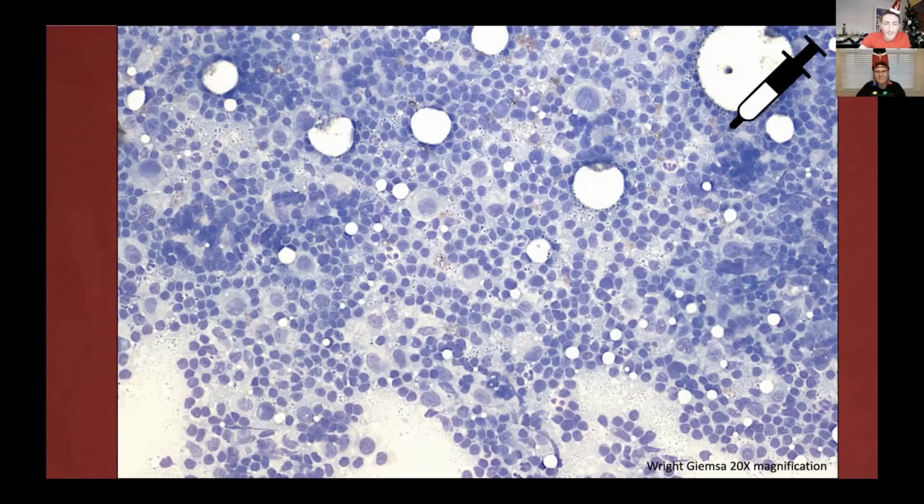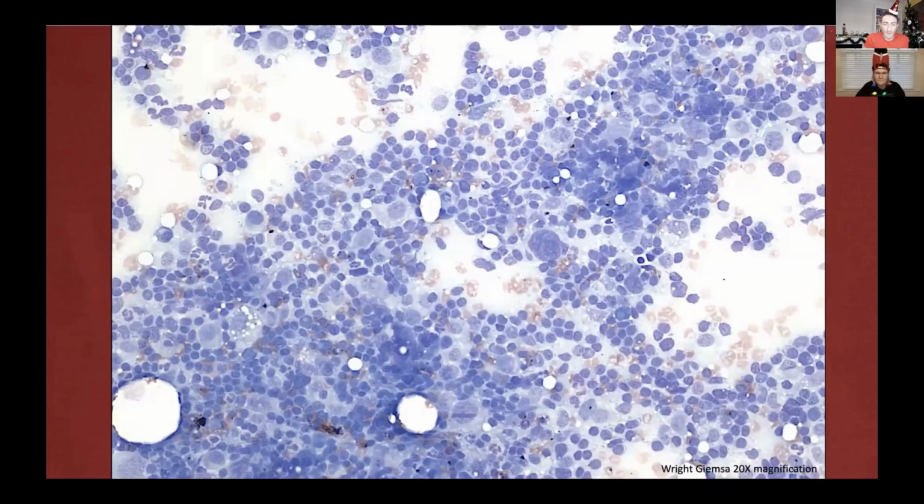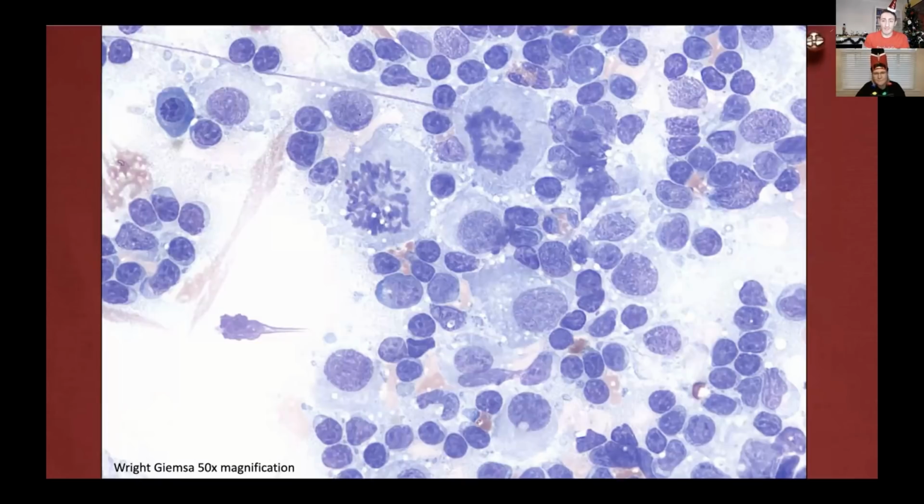But then there are a few cells that definitely look, some mononuclear cells are quite large and quite atypical. And I was thinking, what are they? Are they macrophages, histiocytic? What the hell are they? They definitely don't look like mast cells. Here is another one, still at low power, and then a little bit at higher power. Still, I would say a sort of histiocytic, macrophagic kind of appearance. There are two mitoses in the center. We know that mitosis can be seen in macrophages as well, but still quite a few. There is one plasma cell at about 11 o'clock.